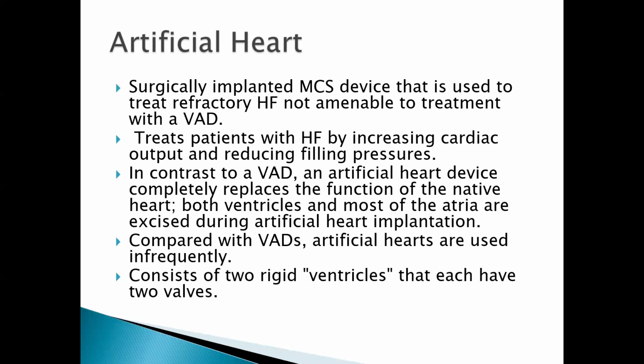In contrast to a ventricular assist device, an artificial heart completely replaces the function of the native heart, and both ventricles and most of the atria are excised during implantation. So it is not a classical ventricular assist device. Compared to ventricular assist devices, artificial hearts are used infrequently. And this artificial heart has two rigid ventricles that each have two valves.